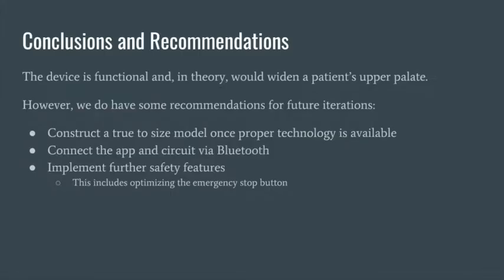So some conclusions and recommendations. In conclusion, the device is functional, and if placed in a patient's mouth, it would, in theory, widen the patient's upper palate. There are still some recommendations that we have for future iterations. So the first one would be to construct a properly sized model, and that would be able to happen once there is the proper technology available.